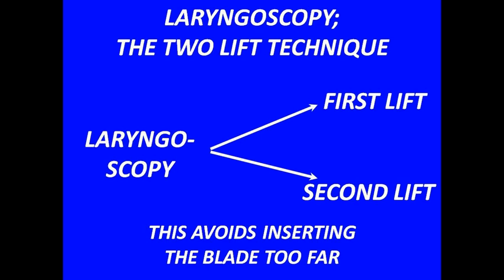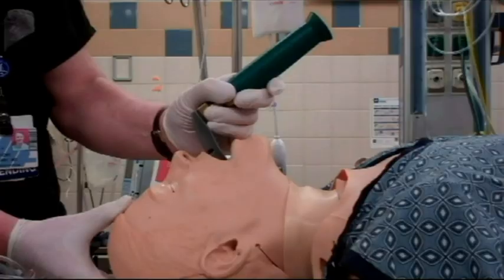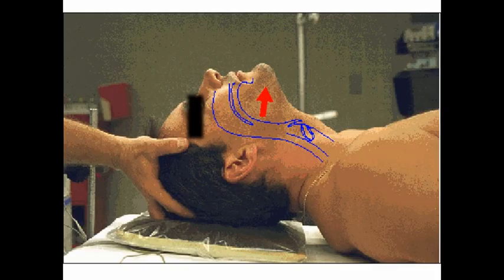The direction of lift of the laryngoscope handle will be upwards to where the wall of the operating room meets the ceiling of the operating room, and this motion elevates the tongue and the patient's mandible in a fashion exactly analogous to the jaw thrust. This is just like doing a jaw thrust internally rather than using pressure on the mandible externally to lift the mandible.